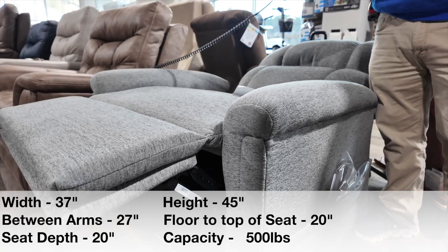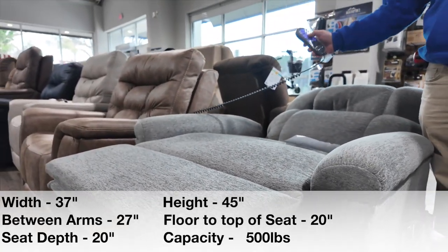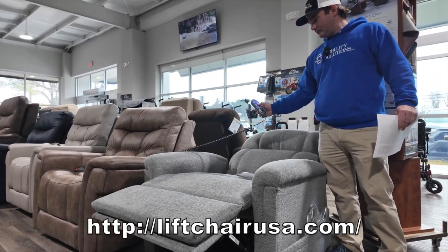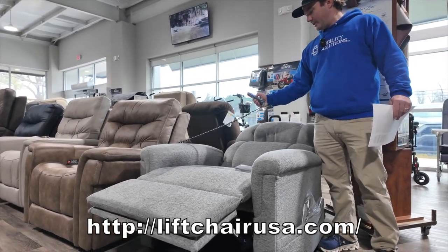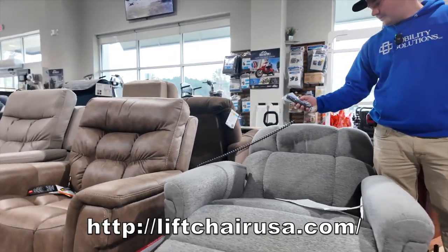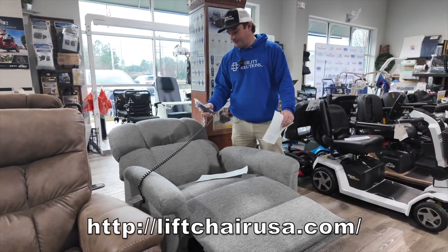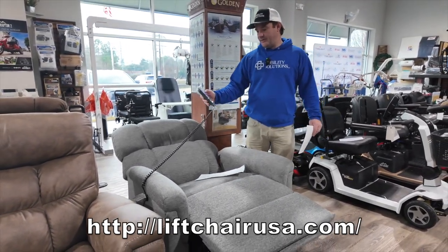This is in zero gravity currently. Then I can press the sleep button and put it in a sleep position — bring the back down. This would be your sleep position, and then you have your TV watching.